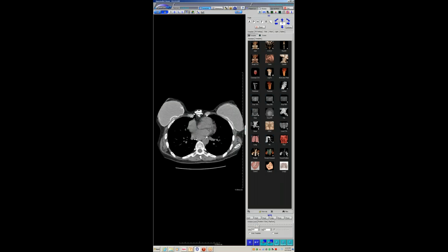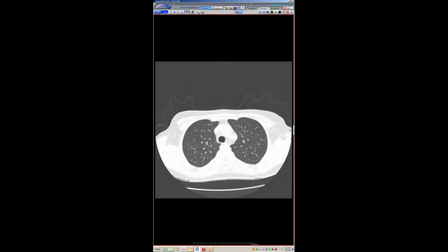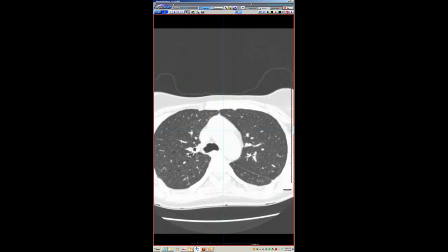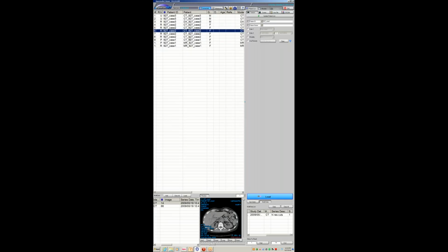Yeah, the CT from 14 months before, minus the little recurrence of the cyst, looks completely normal. But whatever it is, it did happen in that time frame. And the other thing is, there might have been a viral infection that led to this scarring too. There might have been an infection. Absolutely. We're seeing the residuum of that. Absolutely, yeah. It could have been infection. That's the thing that we were postulating.